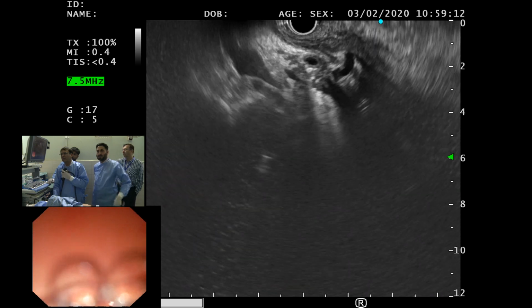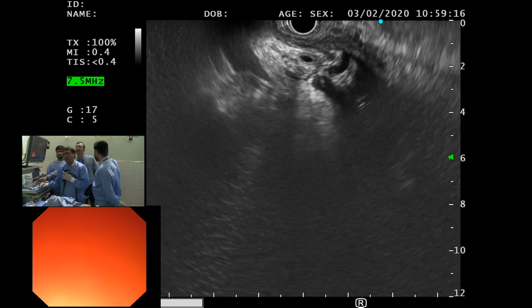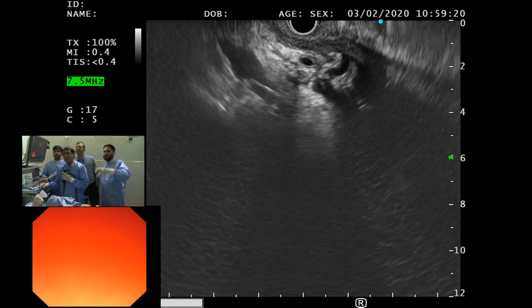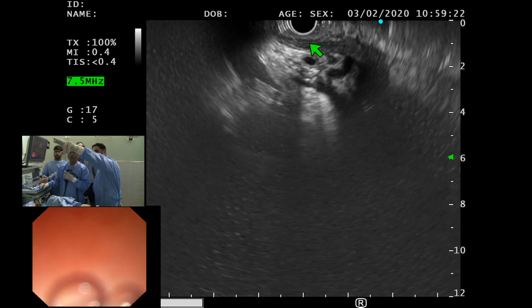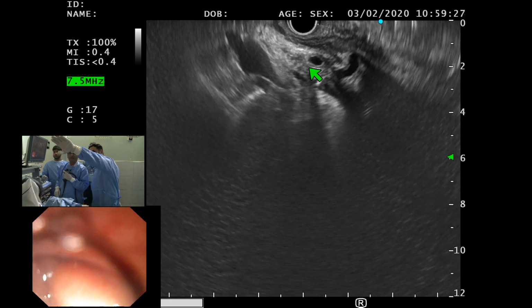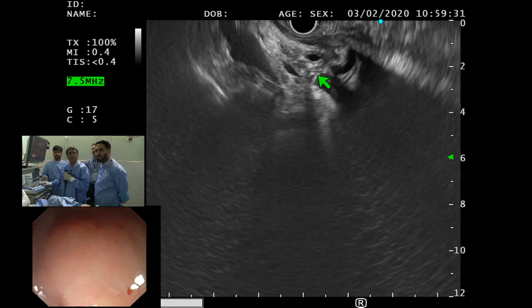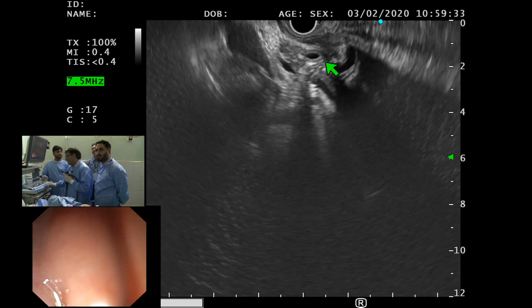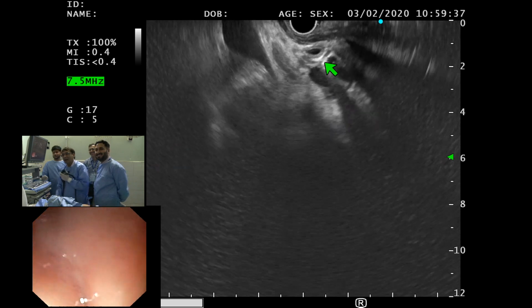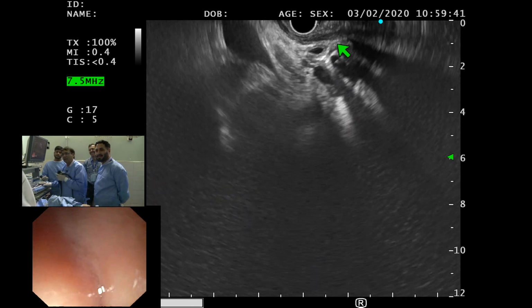Is the lymph node... This is inflamed. No. That duct? Bile duct wall. No sir, the rest is all inflammation. Okay. What happened? How did it come? So it came. He says that when he pushed, it got fixed.